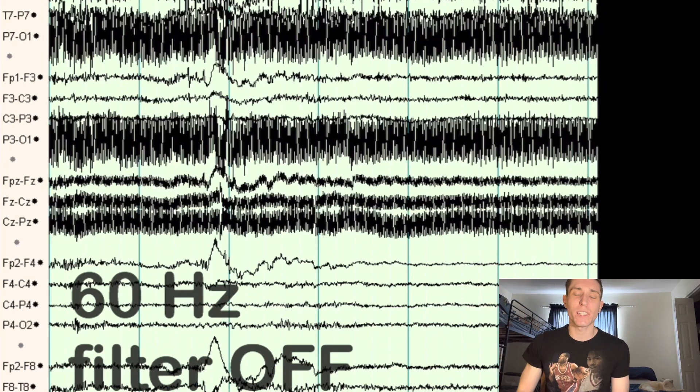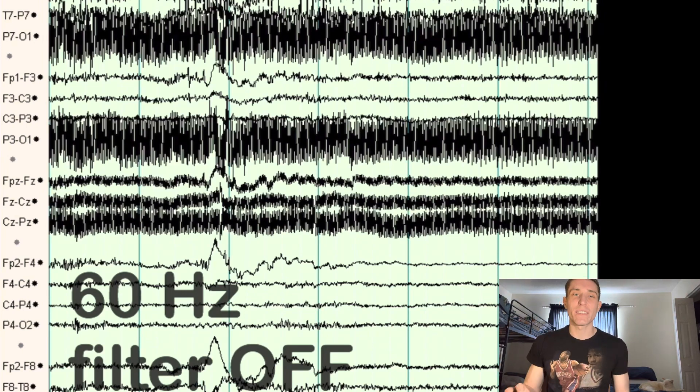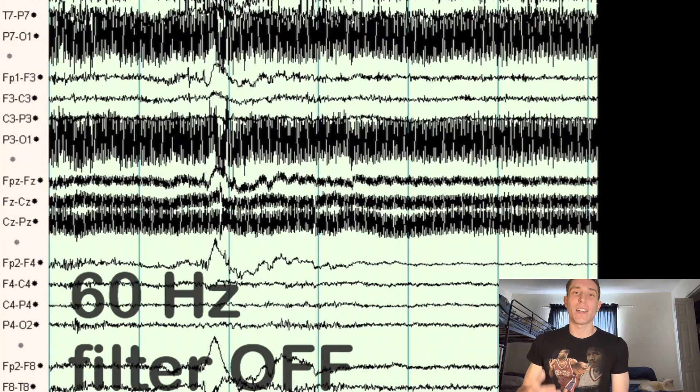Now if you put on the 60 hertz or notch filter, as it's sometimes called, it will erase this artifact completely and you'll be able to clearly see the EEG. So that's another very helpful filter that I use on almost every EEG. A way to reduce 60 hertz artifact is to have very low and equal impedances. When you're checking the impedances on your electrodes while placing them, you're going to want to have them under 5000 ohms, so they're all low and equal, that will reduce your 60 hertz interference.